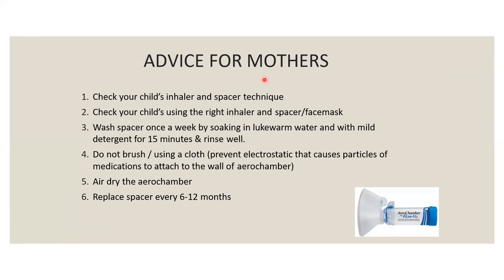Now, advice for the mothers on how to monitor the child's usage of the MDI. The mother should check the child's inhaler and spacer technique. Is it a correct technique? Incorrect technique will waste the medication, as it will not be delivered to the lung directly. The mother should also check that the child is using the right inhaler and spacer or face mask. Is it an appropriate size for the child's face?